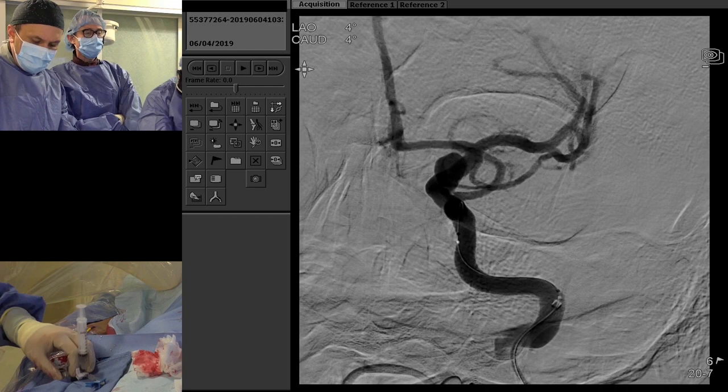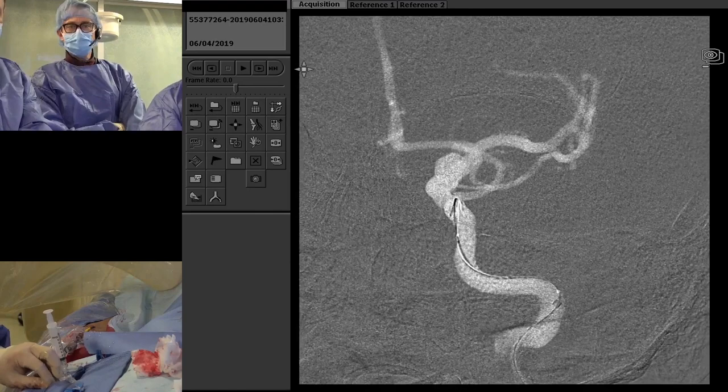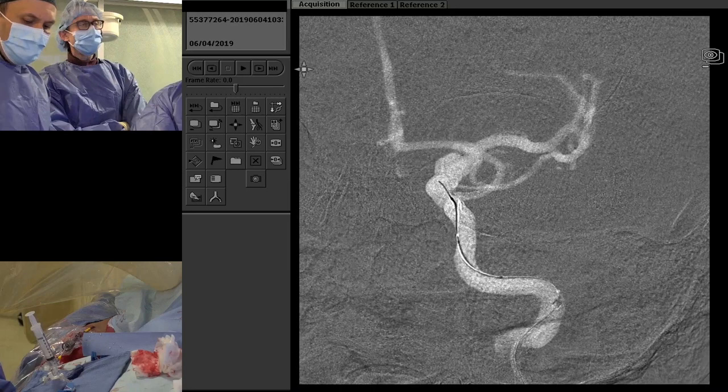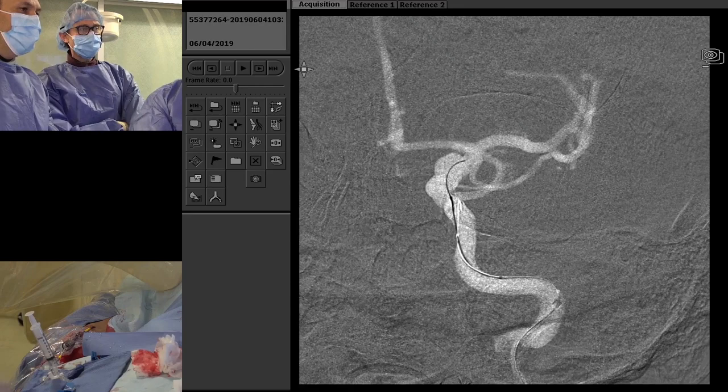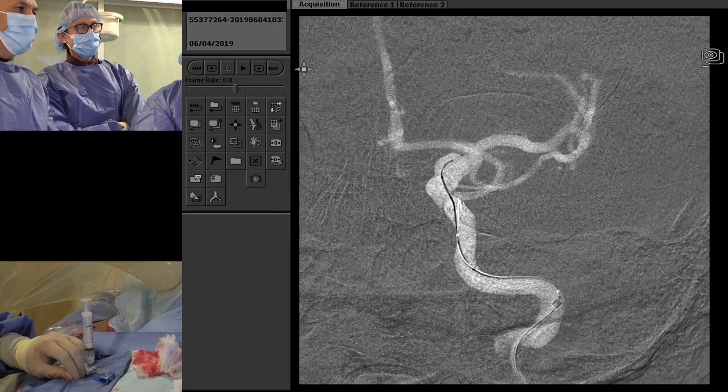The setup is the Neuron Max, which is more or less hubbed at the wrist and up at the origin of the internal carotid artery in the neck, with an 050 intermediate catheter just below the petrous segment of the ICA, and a microcatheter. Right now he's accessing the aneurysm with the microcatheter, and we're going to put a couple of coils.